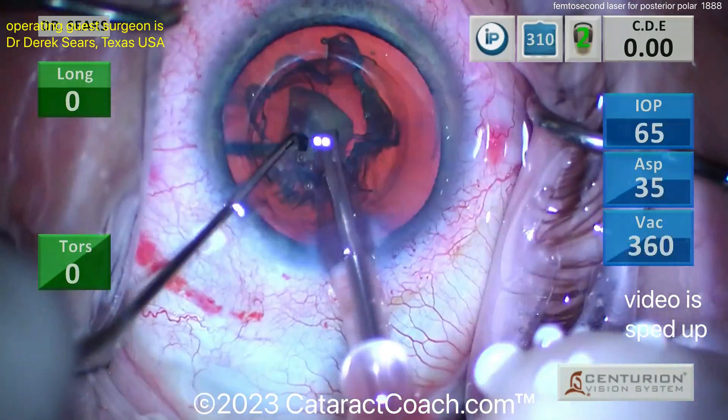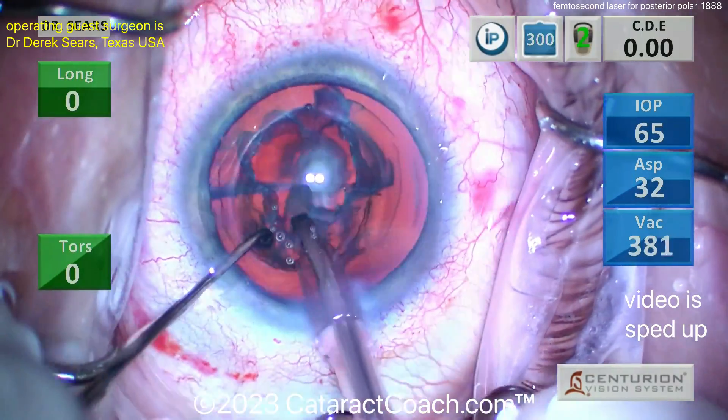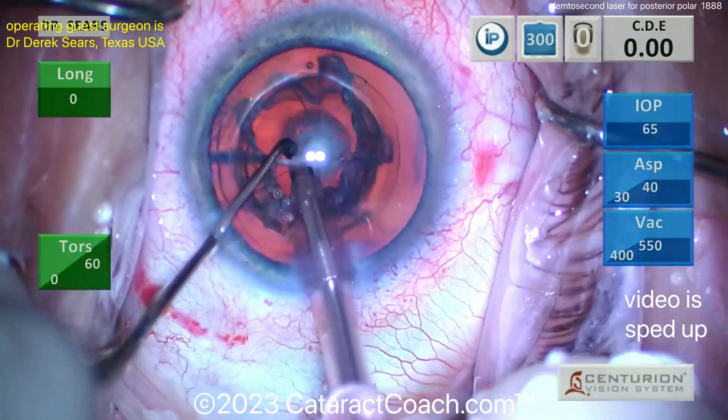Usually for a femtosecond laser I don't like to use those for a posterior polar, just because I'm afraid of those bubbles. But obviously this case shows you can do it and have a very nice result. That looks good, but we're not out of the woods yet.